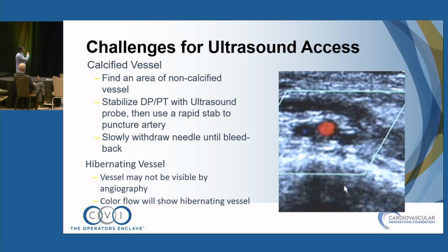Hibernating vessel, this is pretty awesome for ultrasound because you're not going to see flow by angiography, but you may say, oh, patient's got desert foot. There's nothing to do, there's no targets distally, but put an ultrasound probe on there. You're going to have to look at it with duplex, so you may not even see color because there's just not enough flow. So just look at the vessel itself and see if it's occluded or not. This is not appropriate for this talk, but you can even get access to occluded pedal vessels if you need to. That's where ultrasound could be very, very helpful. You can actually get access to a hibernating vessel.